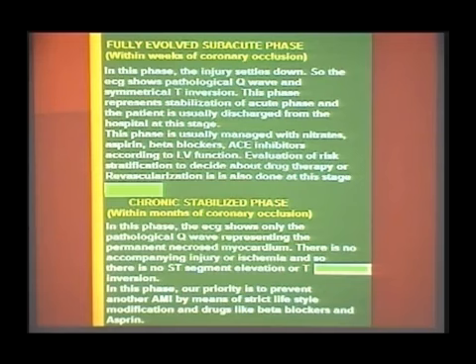So in the fully evolved acute phase, you had infarction, injury and ischemia. Because some amount of blood flow is restored, that injury area goes into the previous stage of coronary artery disease manifestation, ischemia. So that injury area recovers and goes into ischemia. But of course the central core of necrosis cannot be altered. So the central area of necrosis continues to remain as Q wave, whereas your ST segment elevation now settles down. Why does it settle down? The injury is healed. The injury is managed because of the restored blood supply.